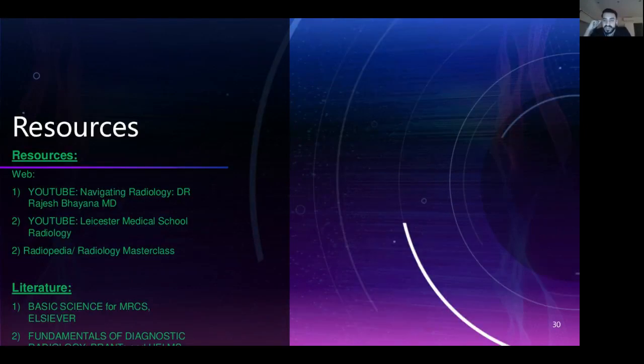But what I can say is that when it comes to cardiac imaging, MRI is very important, especially for looking at things like atrial fibrillation, or, for example, cardiac scarring post myocardial infarction. PET imaging is more on the nuclear side of things, and you don't really use it unless you are thinking of, for example, tumors.